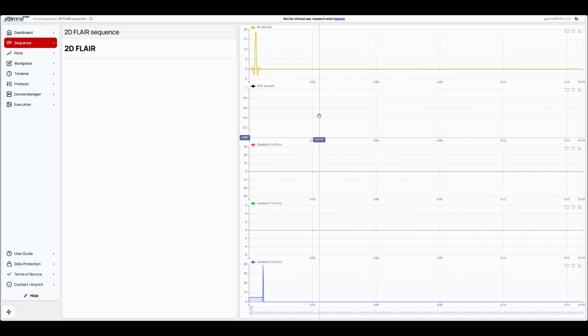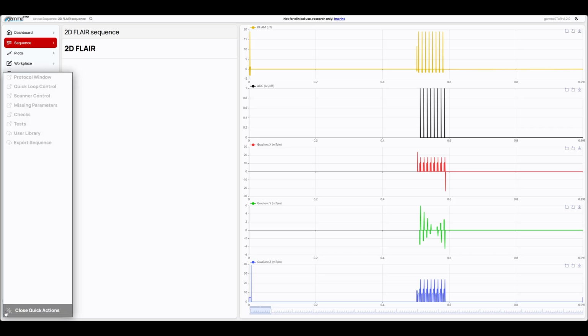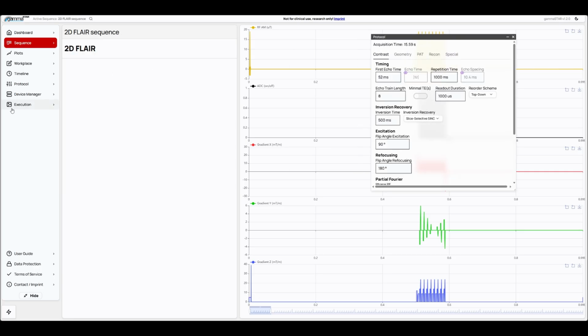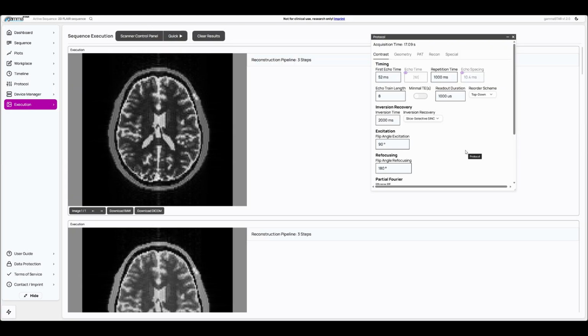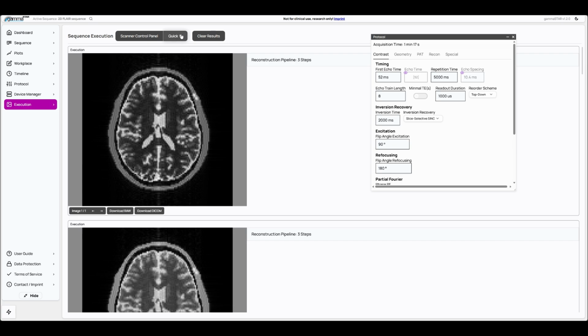So inversion pulse in here, RARE sequence here. So we could probably adjust the protocol parameters a bit, and we could try to get rid of the fluid component. So we probably would add a quite long inversion time because fluid components are quite long and repetition time should be long to prevent ghosting artifacts.